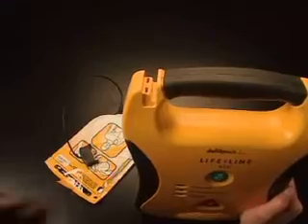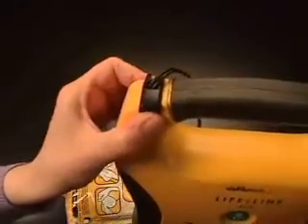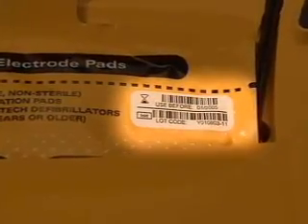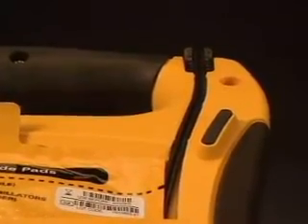To connect the pads to the AED, insert the connector into the slot in the upper corner of the unit. Note that the connector is designed to only go in one direction. Once connected, the pad package should be stored in the holder in the back of the unit. The pad should be stored so that the pad expiration date can easily be seen. Pads past their expiration date should be replaced as soon as possible. The pad cable should be pressed into the slot in the back of the AED.